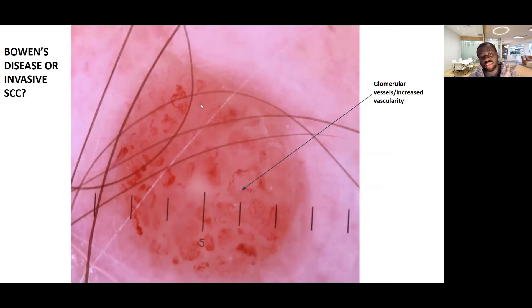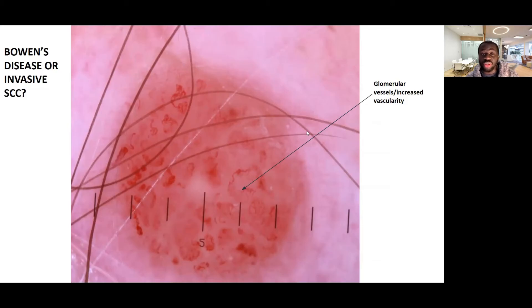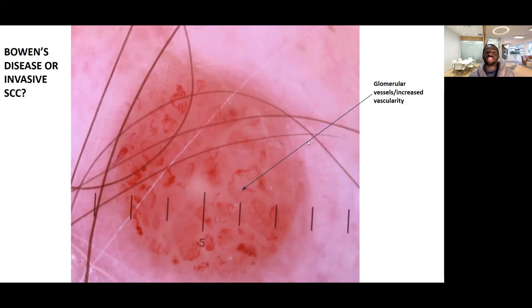Squamous cell carcinoma can have these roundish glomerular-like blood vessels. But if I see a flat, well-circumscribed lesion with this glomerular vascular pattern, I'd more likely diagnose Bowen's disease. I'd follow that patient up, probably prescribe some topical imiquimod or topical 5-fluorouracil for about four weeks to see what effect it has. If it's not improving, the lesion needs to be excised for histological diagnosis to make sure it has not transformed into a squamous cell carcinoma.